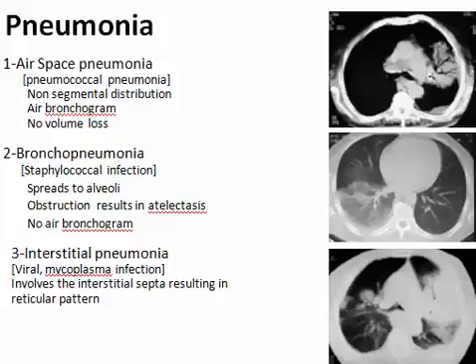I think we discussed this before in airspace pneumonia, as in the well-known pneumococcal pneumonia, or bronchopneumonia as staphylococcal pneumonia, or we have the acute interstitial disease, PCP, viral, cytomegalovirus, and ARDS, all can give this appearance with reticulations.